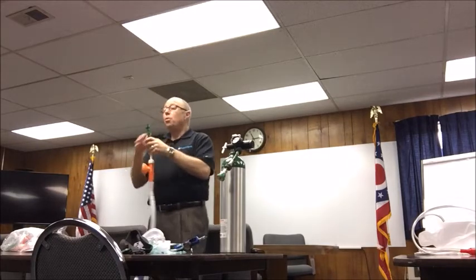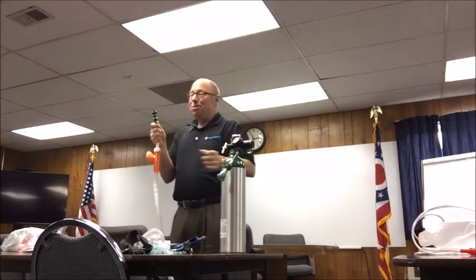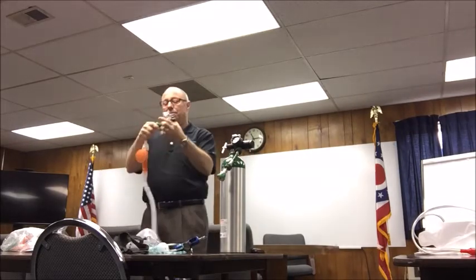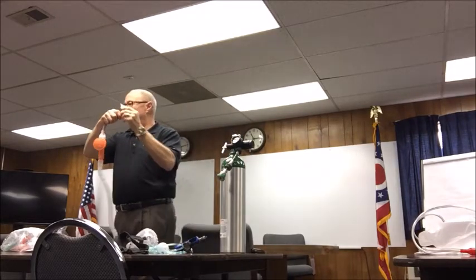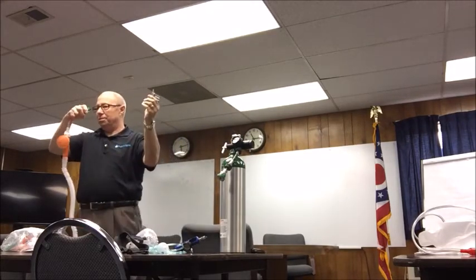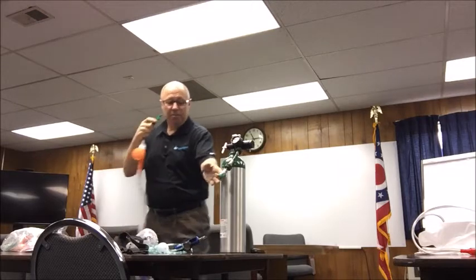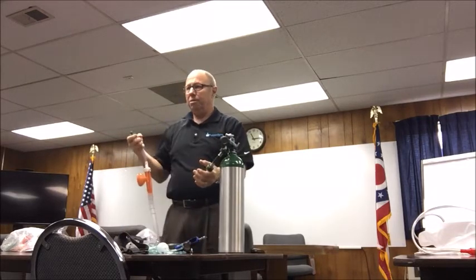Okay. So you don't have the meter on it, but you're going to put it on there. Show them how to take that out of the wall. How to take it out of the wall? Just twist it. Just like breaking a pencil. You can't pull it like this. Just twist it. That is a normal issue among all departments. You're not going to break it. Same thing with here. When you're into your flow meter or into your tank, just twist it.